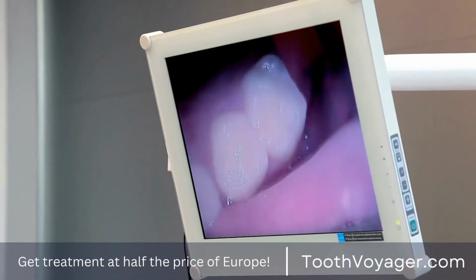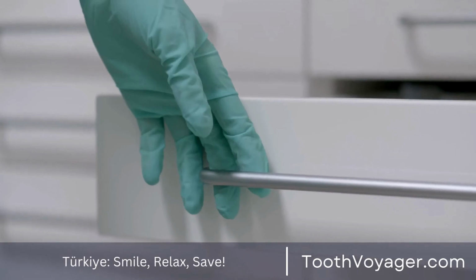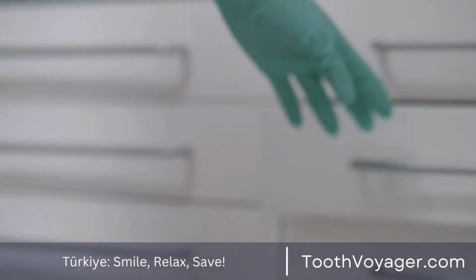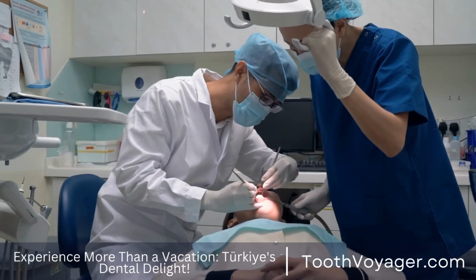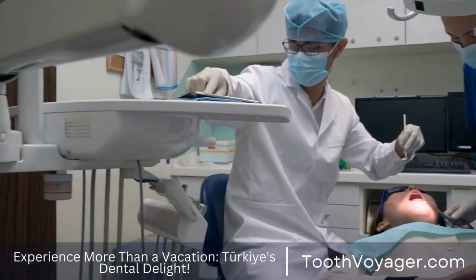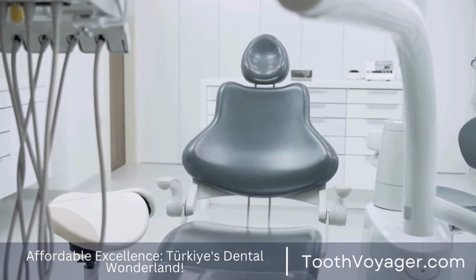Surgical placement. The following stage in the implant dentistry procedure is surgical placement of the implants. The procedure typically takes place with local anesthesia and requires the dentist to make an incision into the gums of the patient so that the jawbone is exposed. Implants are placed in the jawbone and left to meld with the bone over a period of many months. After the implants have healed and bonded to the bone, the final restoration is able to be put in.